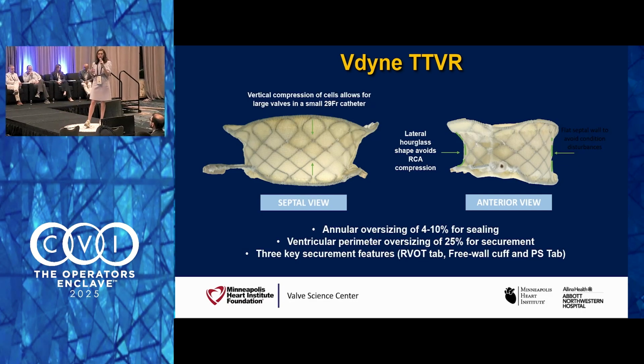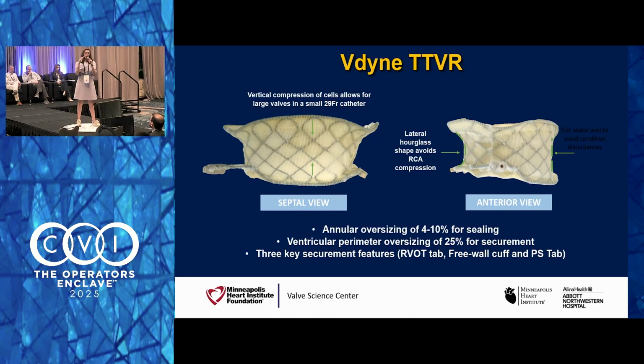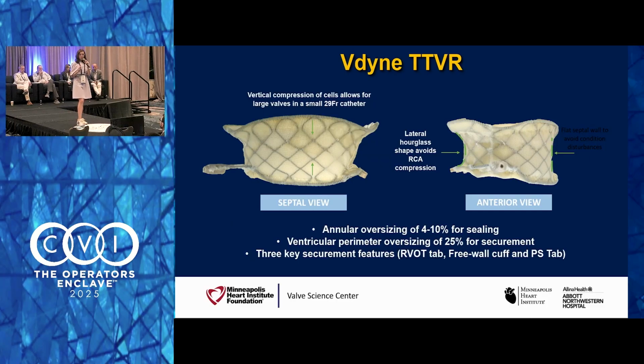So before this case, we were talking about it, right, Paul? We were talking about using this pop-off hole, and the pop-off hole is literally round, and from echo, you will leave the patient with at least about mild to moderate. I calculated on the 3D VCA to offload that, to help that RV. So that's something that we were thinking of going into this case.